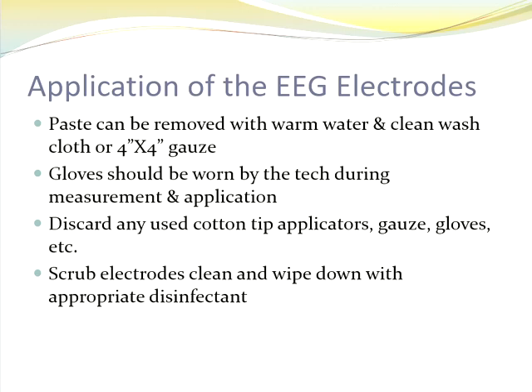The paste is water soluble. It does come off in the shower. I tell my patients this. They can try to take it off with a piece of gauze with warm water. I don't take it off for my patients. I find the easiest way is just hop in the shower because, just really saturate it with water.